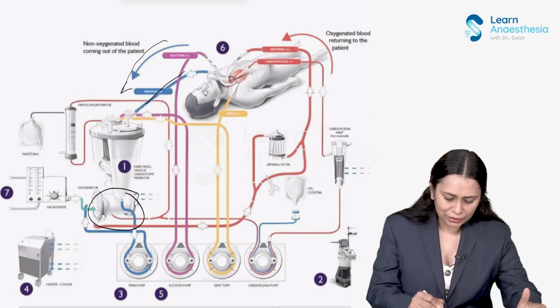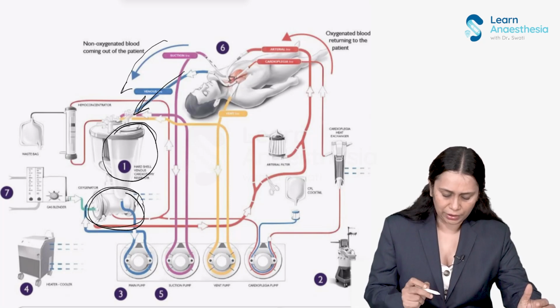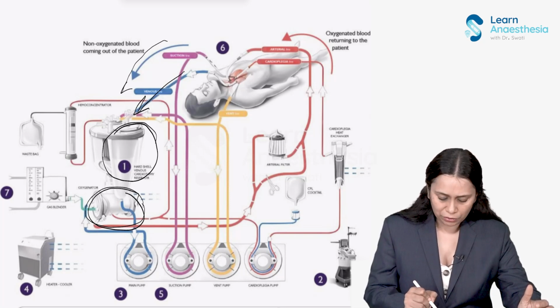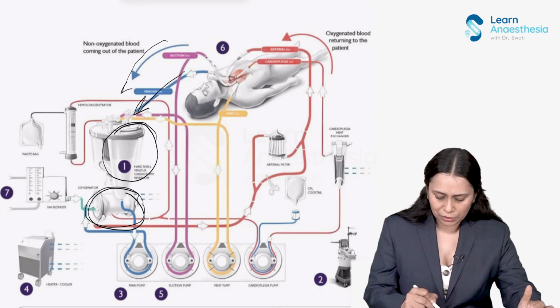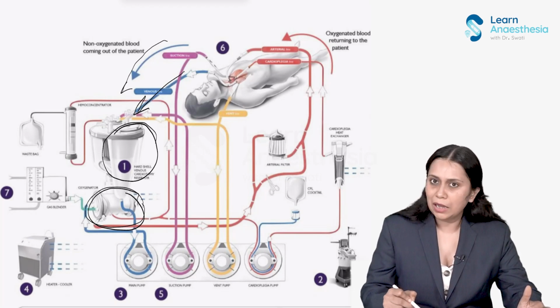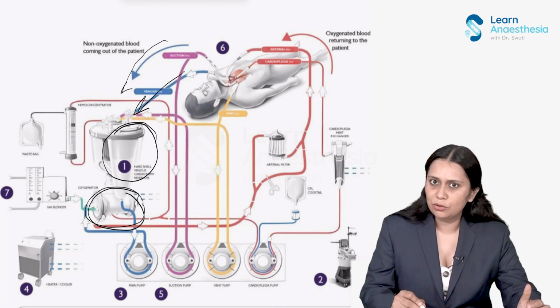So passively the venous blood goes into a reservoir, and from that reservoir it will pass through the oxygenator. Okay, and through the main pump it goes into the oxygenator, and then from that oxygenator the blood will go through the arterial pump back into the body.